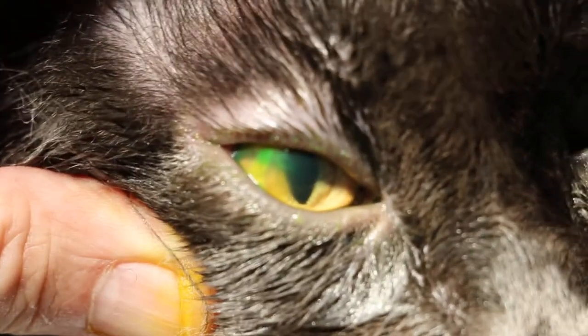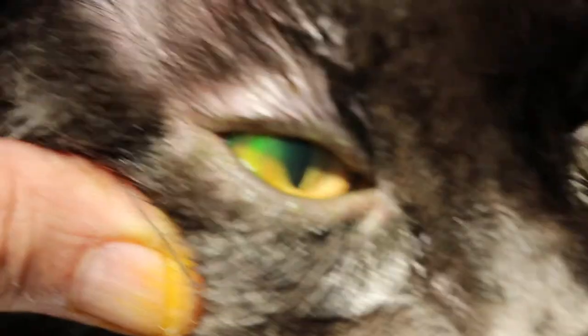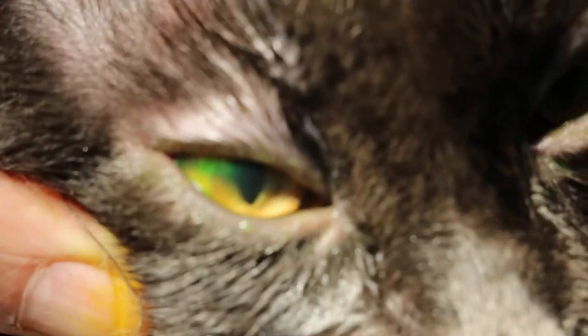Hold the scarf on the neck — just to show the owner. There you see, this side is from 7 o'clock to 10 o'clock.